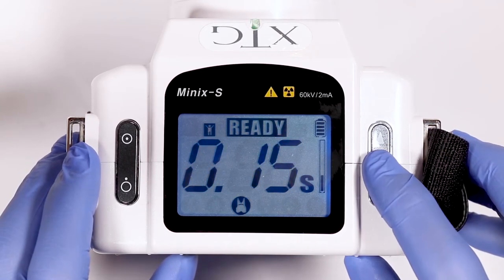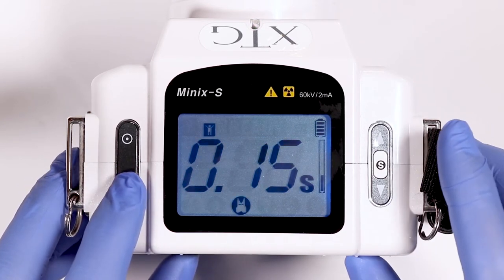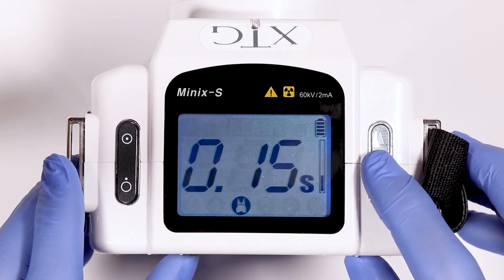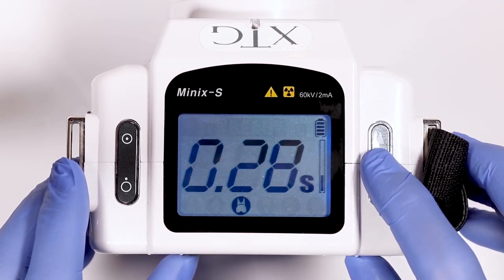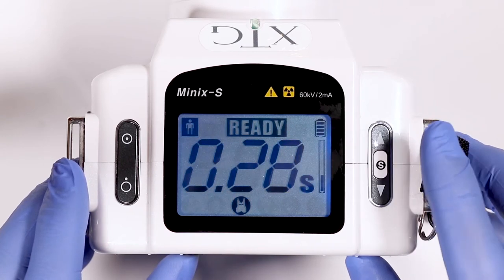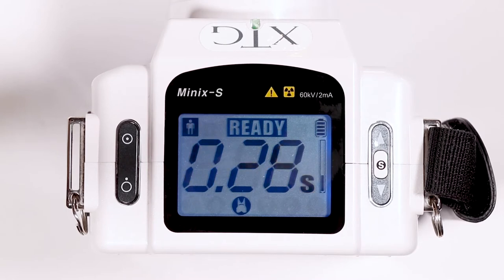To change back to adult, press and hold the S button. Then press the power off button. Press the S button again and it will change back to adult. To save the adult setting, just press and hold the S button. It'll save and you'll see the ready sign.